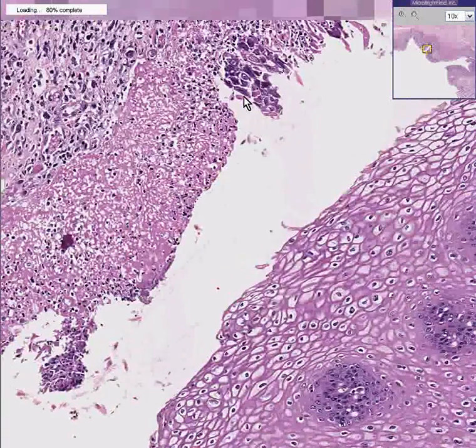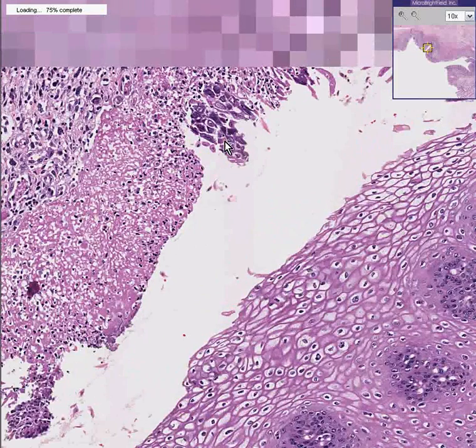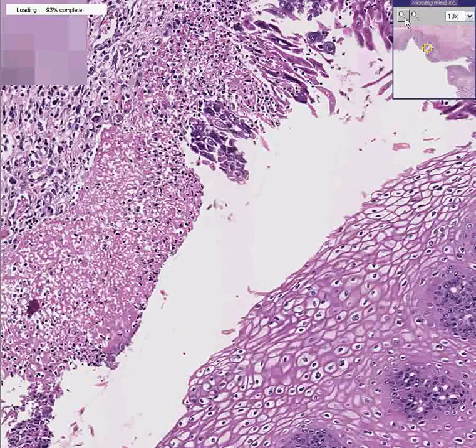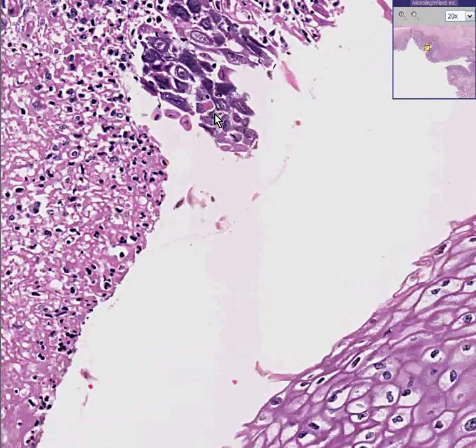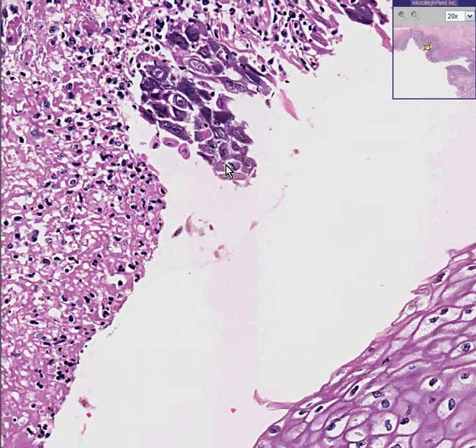Here's an area where there's some residual epithelium. So let's take a look at that, because that seems to be the worst part of the epithelium. Notice that within this epithelium, and specifically within the nuclei, you'll see little red inclusions like here and like here.